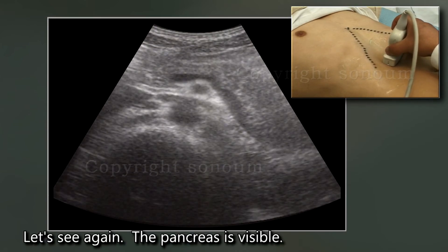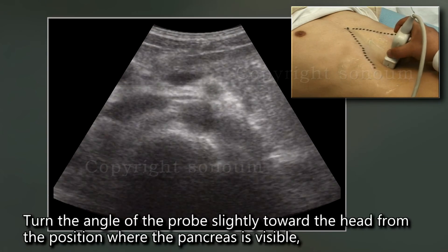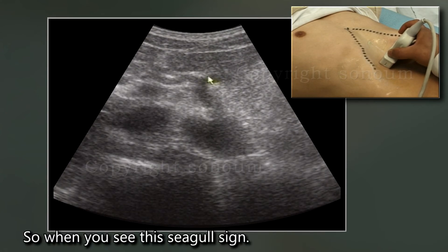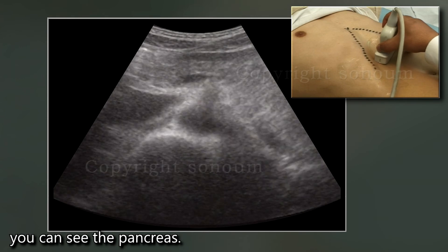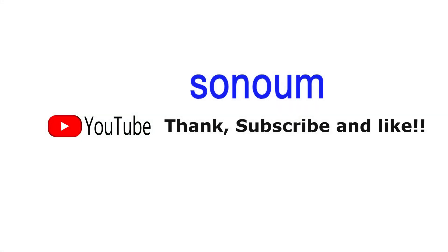Let's see again. The pancreas is visible. Turn the angle of the probe slightly toward the head from the position where the pancreas is visible, and the seagull sign appears. In this state, if you give a slight downward angle, you can see the pancreas.